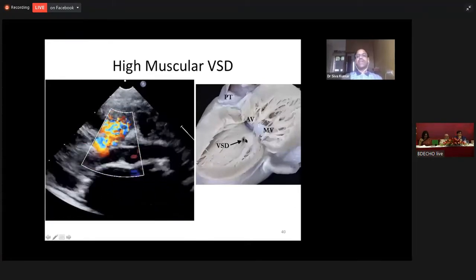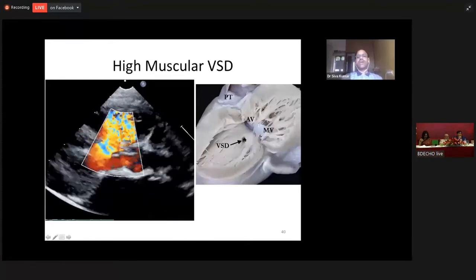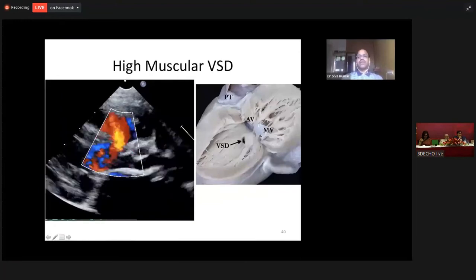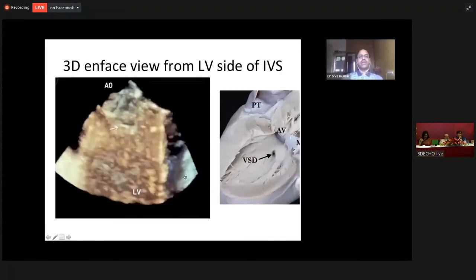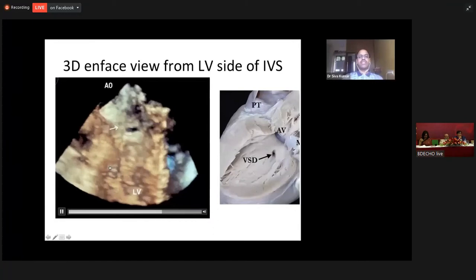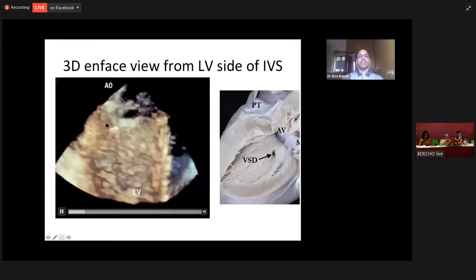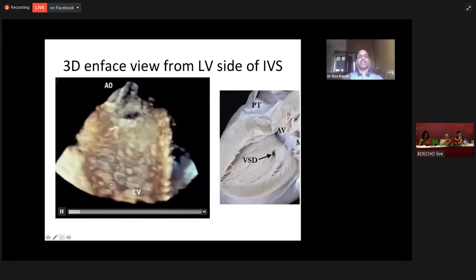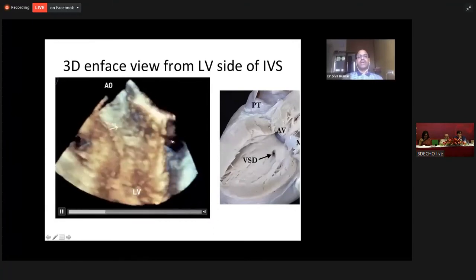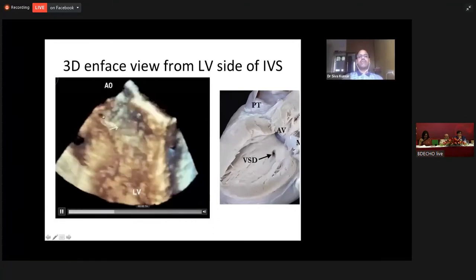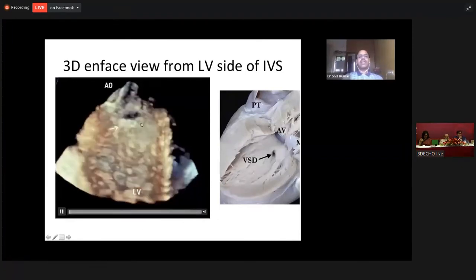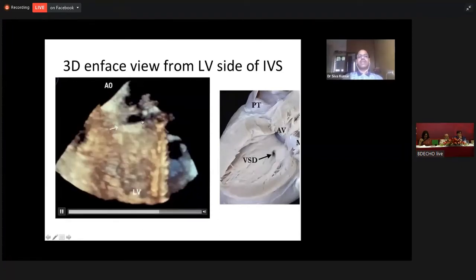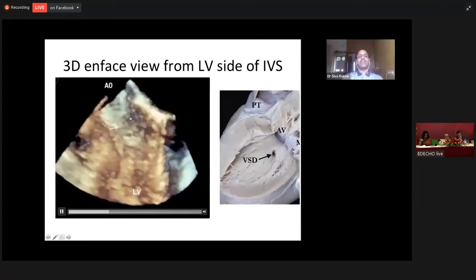This is the morphological specimen of a high muscular VSD. We can see it on a three-dimensional echocardiography — the 3D echocardiography of the left ventricle in its basal part superiorly, apex inferiorly. You are able to appreciate the high muscular ventricular septal defect, which is separated from the aortic valve.